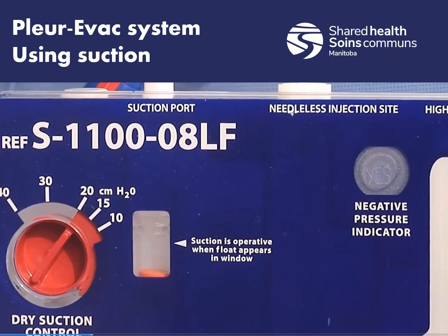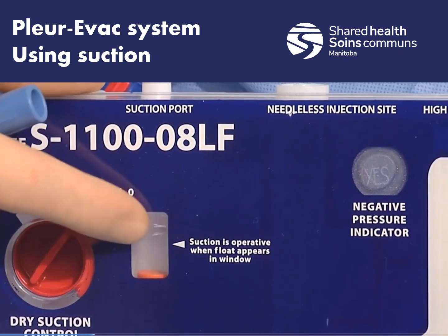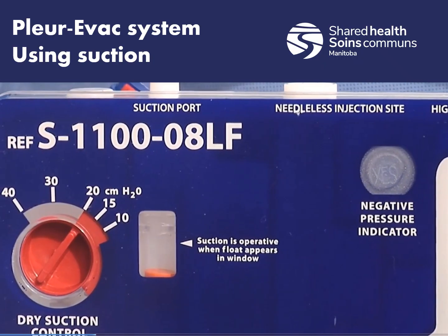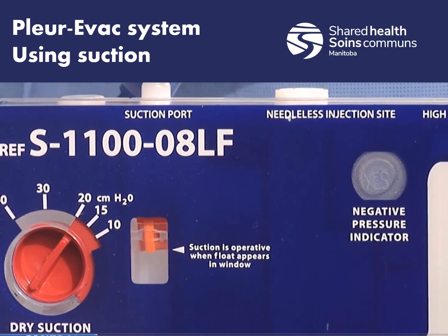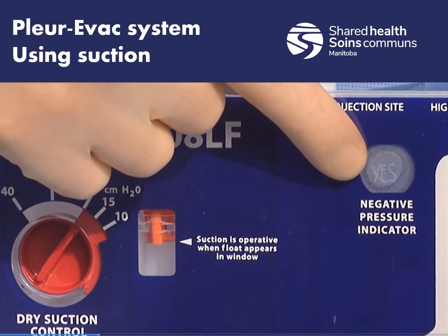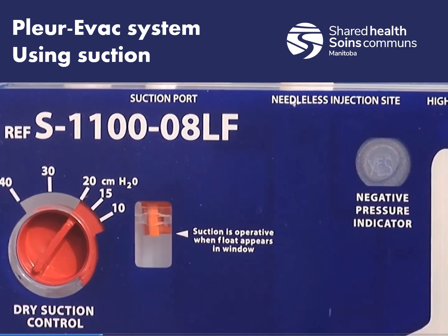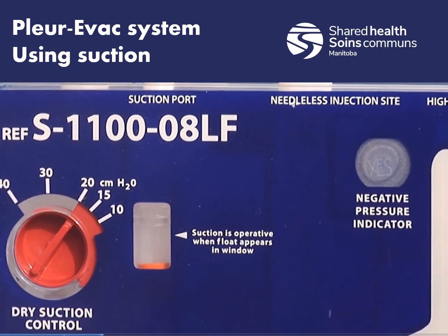To make sure our suction is actually working, you can see we've still got it set to -20, that's what they wanted. We're just going to apply our suction, and we're going to turn up our suction until this little float appears in the window. This tells you that your suction is still good. Again, this is something else to watch, because if you do have a wall-mounted suction and that little indicator is at the top and all of a sudden it's not floating anymore, that could show us that we don't have active suction, such as there.